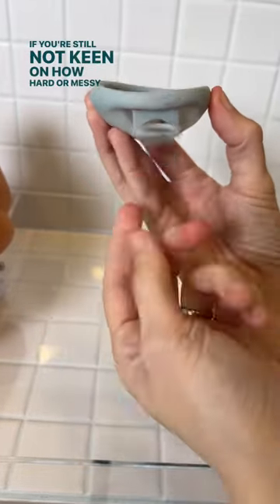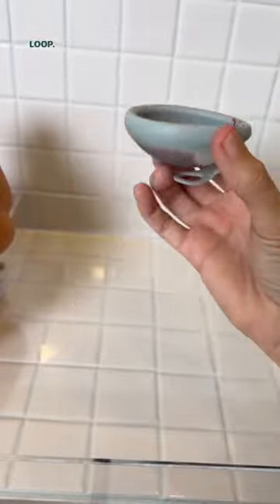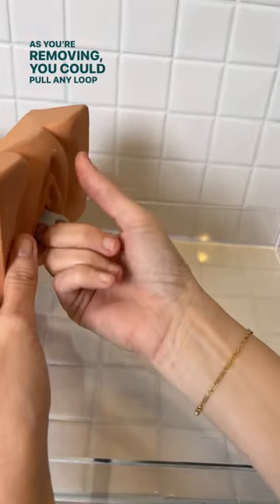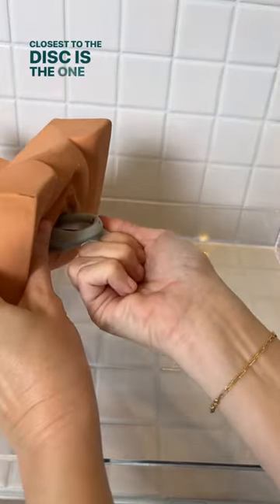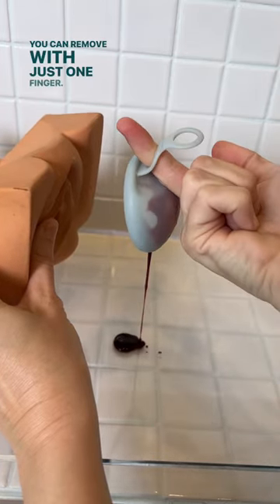If you're still not keen on how hard or messy it can be to remove other discs, try a disc like HelloDisc with a removal loop. As you're removing, you can pull any loop, but the loop closest to the disc is the one with the most control. The design is meant to protect your finger as you remove, and you can remove with just one finger.